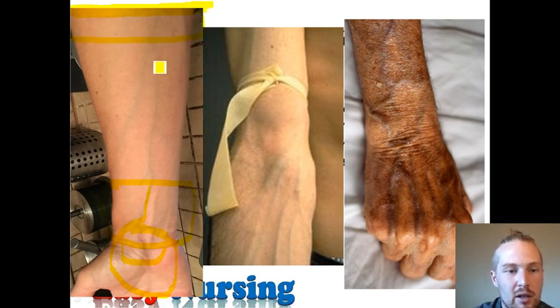So I can see a perfectly straight vein here. If I were to do this, I'd probably do it. You can see a bifurcation. Avoid this. I would probably start my IV right here in the vein. This one, I see it's straight all the way up.